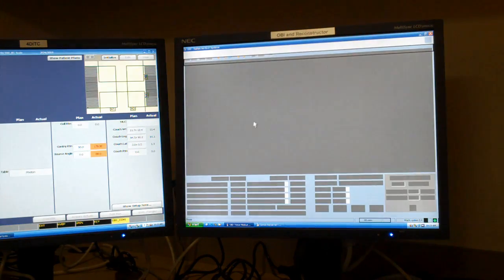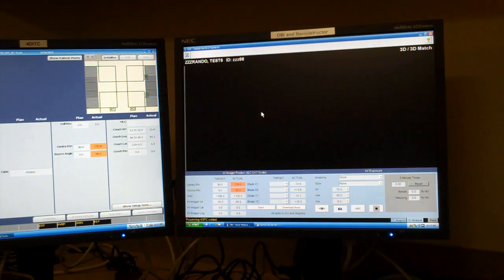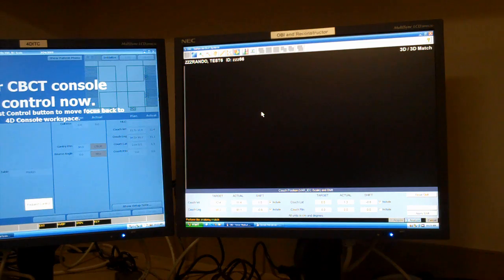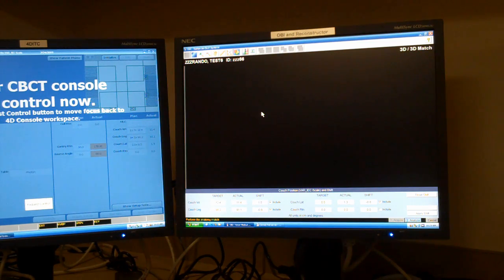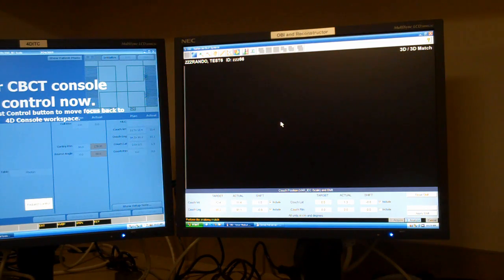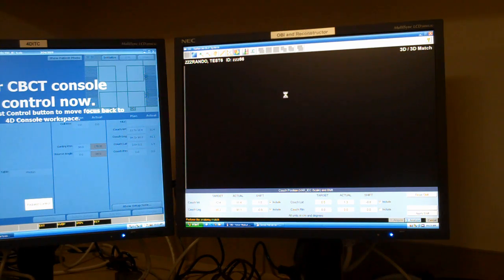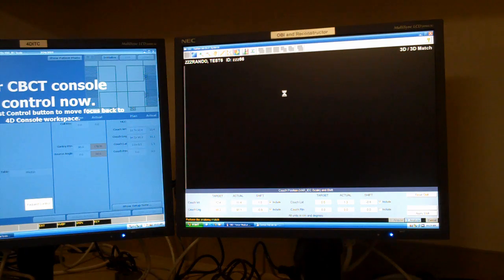The nice thing about Cone Beam CT is the 3D-3D automatic matching works extremely well. It's very hard to miss. So here, just loading in the Cone Beam CT and the reference CT.